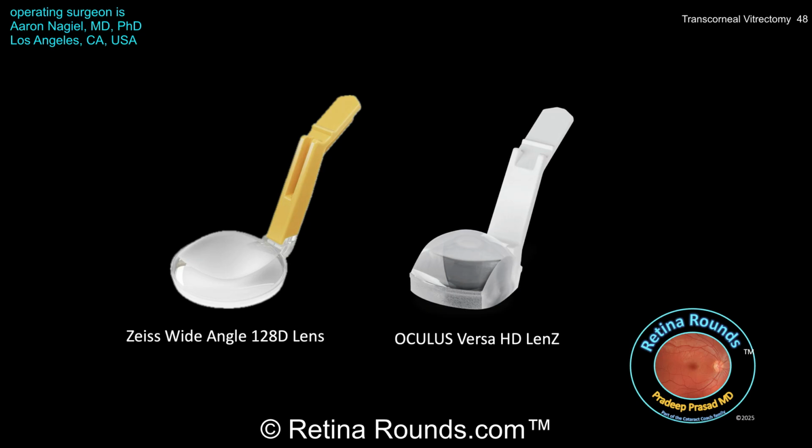Well, typically wide-angle viewing is going to be achieved with the Zeiss 128 diopter lens. However, in this particular case, because of the transcorneal approach and because it's a pediatric eye, the vertical approach is going to be too difficult. Those instruments will bump up against the side of that Zeiss wide-angle lens. And so instead, Dr. Nagiel is using the Oculus Versa HD lens. You can see here that the sides of the lens are almost chopped off, and that allows for the instruments, both the light pipe and the cutter, to be angled more vertically to be able to perform the surgery.